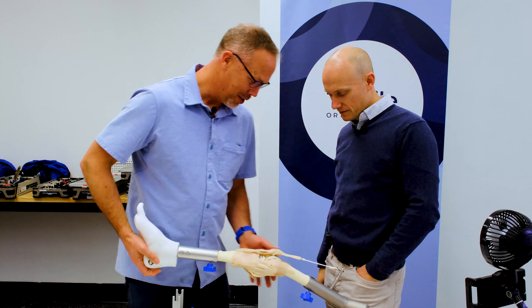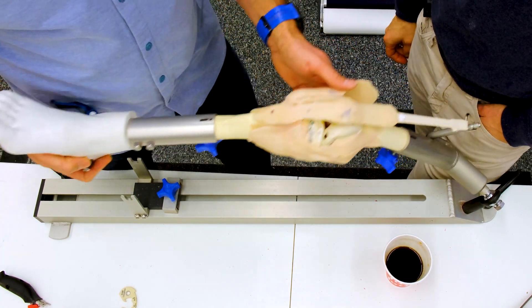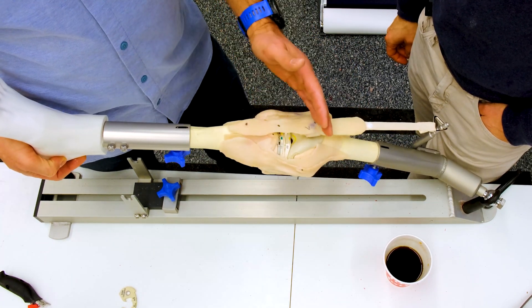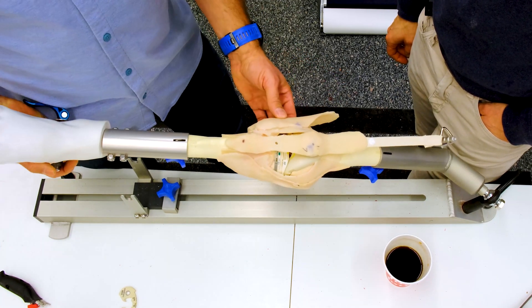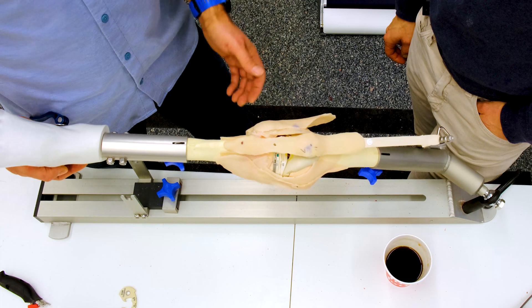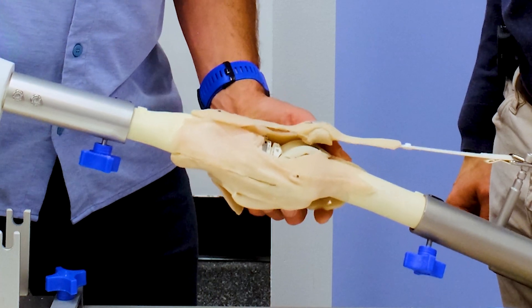We've gone through another demo of a total knee replacement and we're at the trial phase and we've screwed it up and we're not liking what we're seeing. I've got femoral cuts made, tibial cuts made, we've tried to balance our flexion extension gap and now I'm testing the trial. What I'm seeing is that just with me holding the heel, I still have a significant flexion contracture — the knee is not sitting appropriately. I can push it into extension but it's very tight, so my extension gap is way too tight in this scenario.